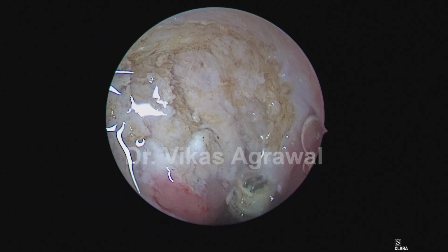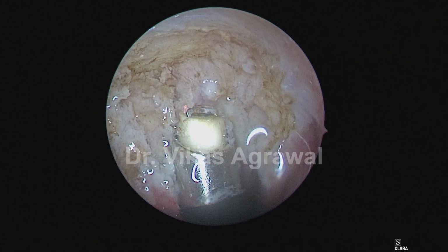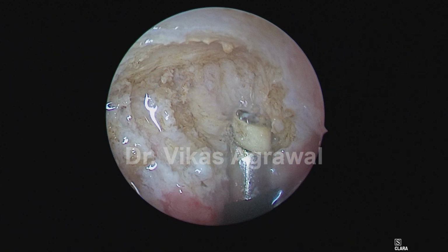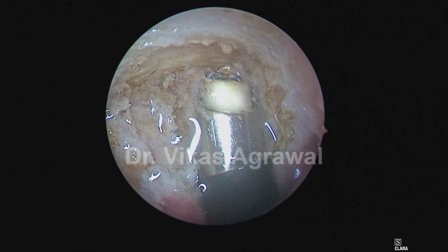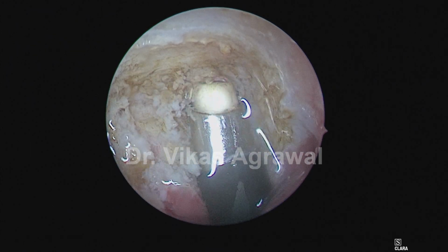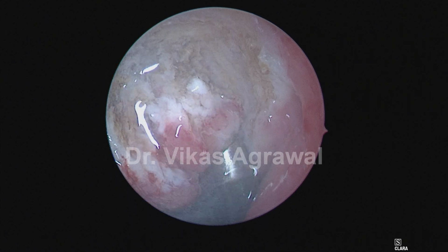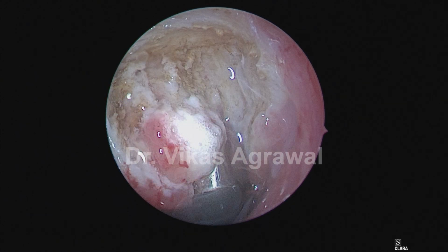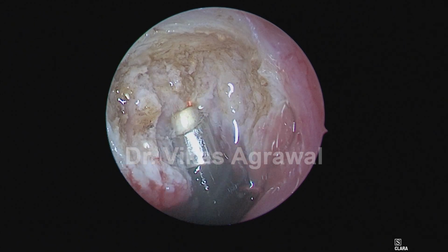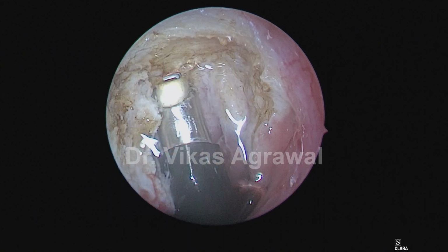Once I clear the lateral boundary in the anterior part, I will gradually go for the lateral boundary in the posterior part, which is the fossa of Rosenmuller. Now I am going towards the fossa of Rosenmuller, and simultaneously I am debulking so that I can see the posterior boundary also. So let me debulk the lymphoid tissues of the adenoids so that I can see the posterior boundary, which is the buccopharyngeal fascia.